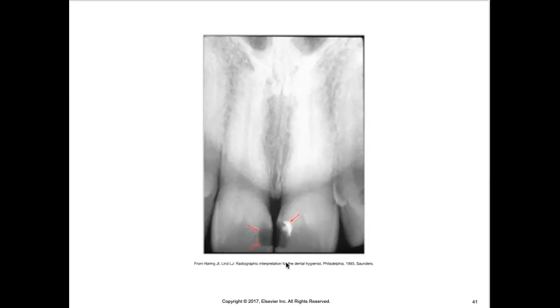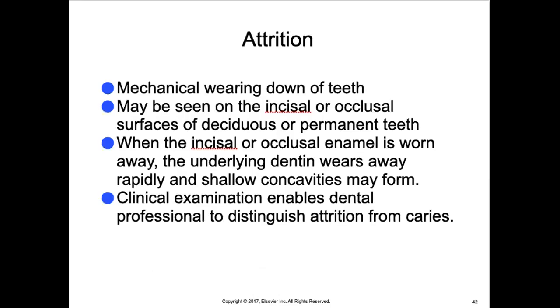Dental caries usually doesn't present itself that smoothly or shaped like that. It's usually wedge shaped, and this is definitely box shaped, prepared by a dentist using a dental drill. This area is very well filled in by a composite material. But again, for a lot of anterior composites that were done in the past, those were known as radiolucent composites, and those do not show, but may look like cavities.